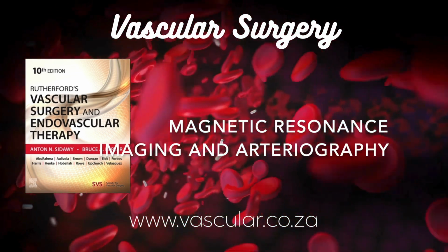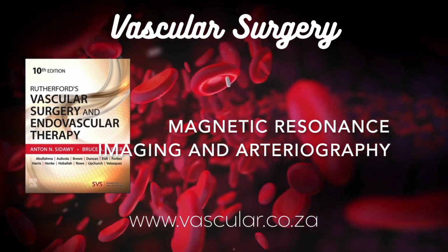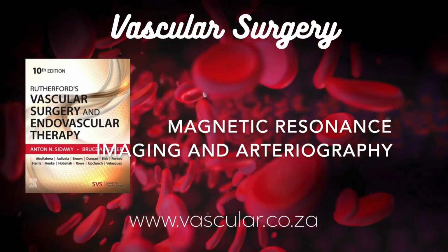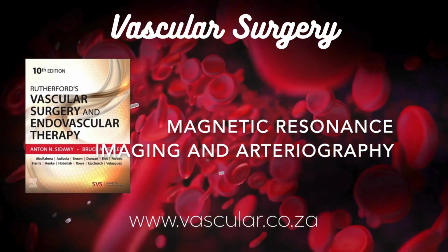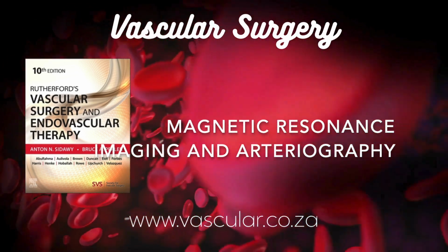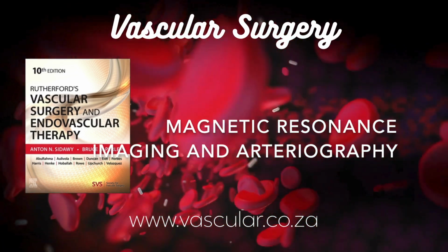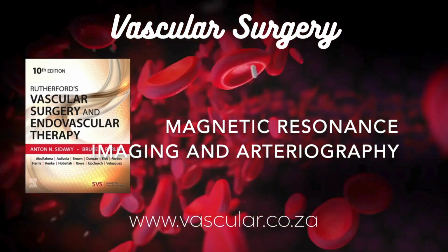Now, what about contraindications? Situations where MRA might be risky. We touched on renal disease and NSF earlier. Can you expand on that? Yes, NSF, nephrogenic systemic fibrosis. This is the big one related to contrast. It's a debilitating, sometimes fatal, disease causing skin thickening, joint contractures, and potentially organ fibrosis. And it's linked to gadolinium. Strongly linked, yes, specifically in patients with severe kidney impairment like those on dialysis or with very low kidney function, low GFR. The thinking is that if the kidneys can't clear the gadolinium quickly, it stays in the body longer and the gadolinium ion might detach from its carrier molecule and trigger this fibrotic process.